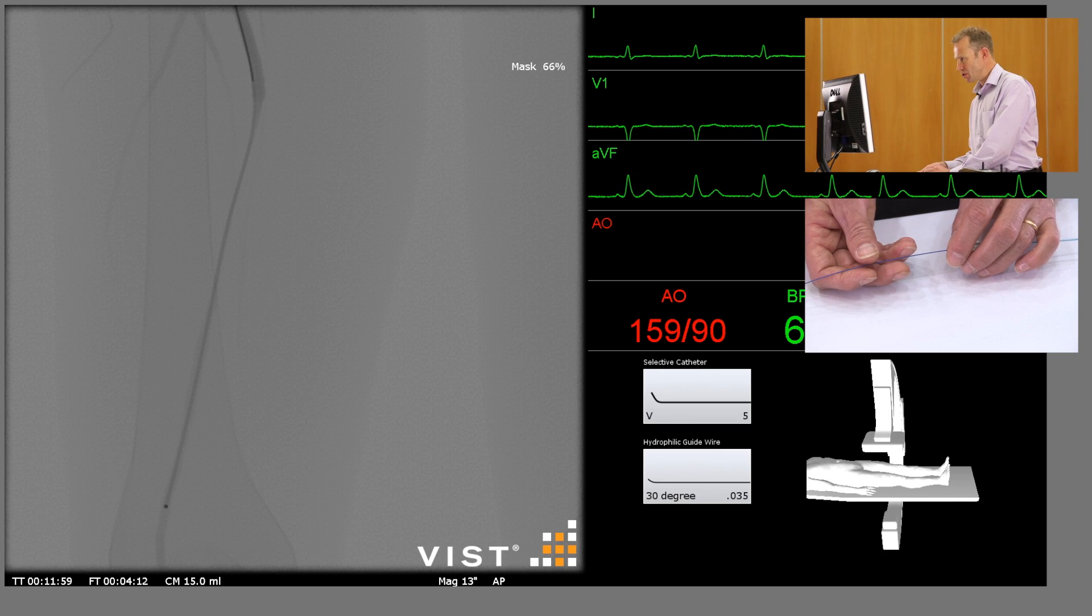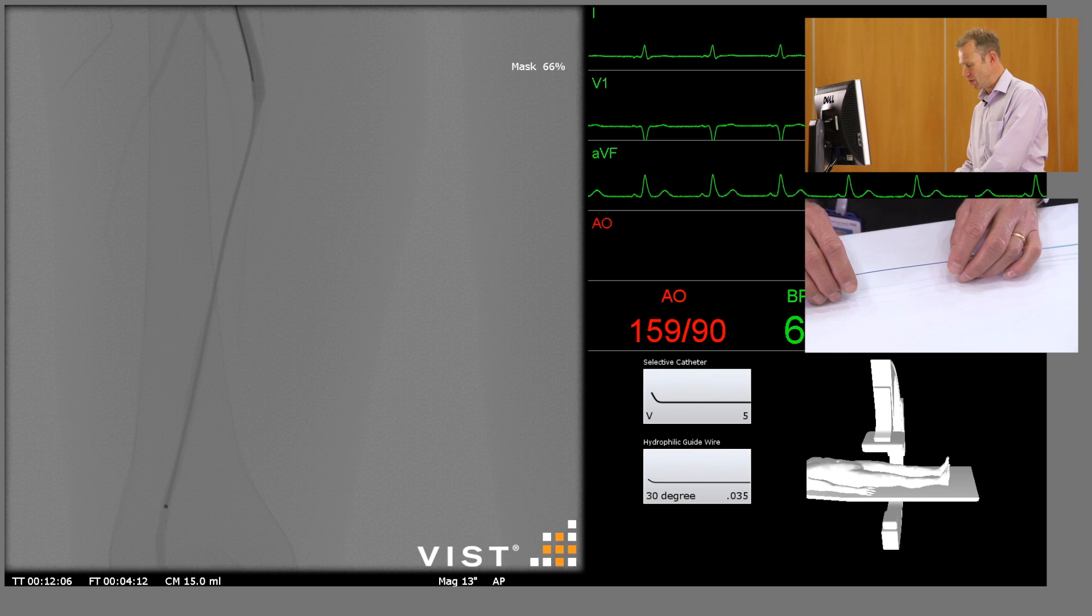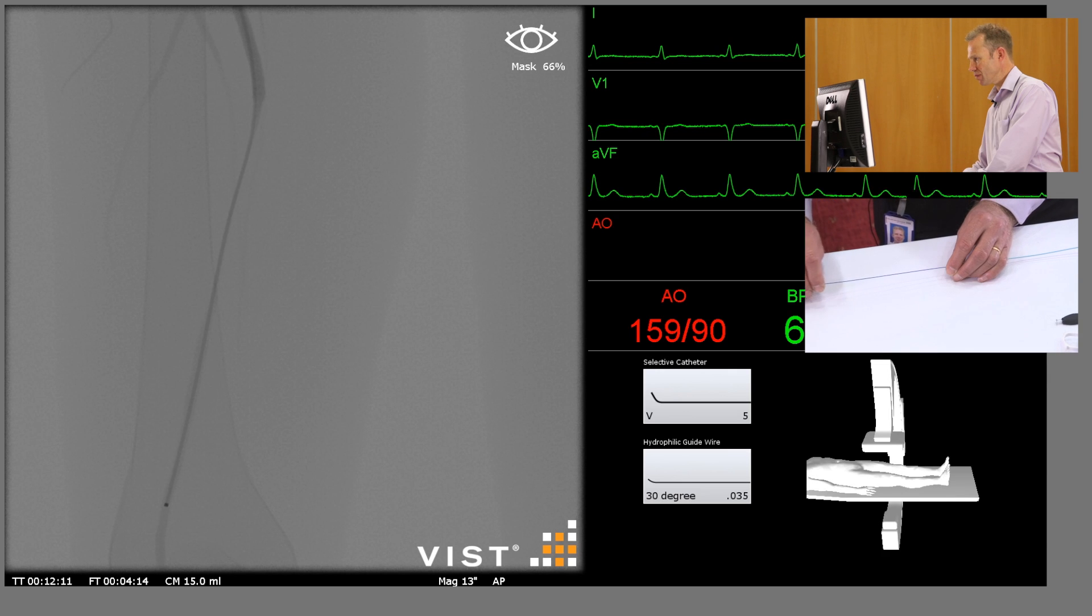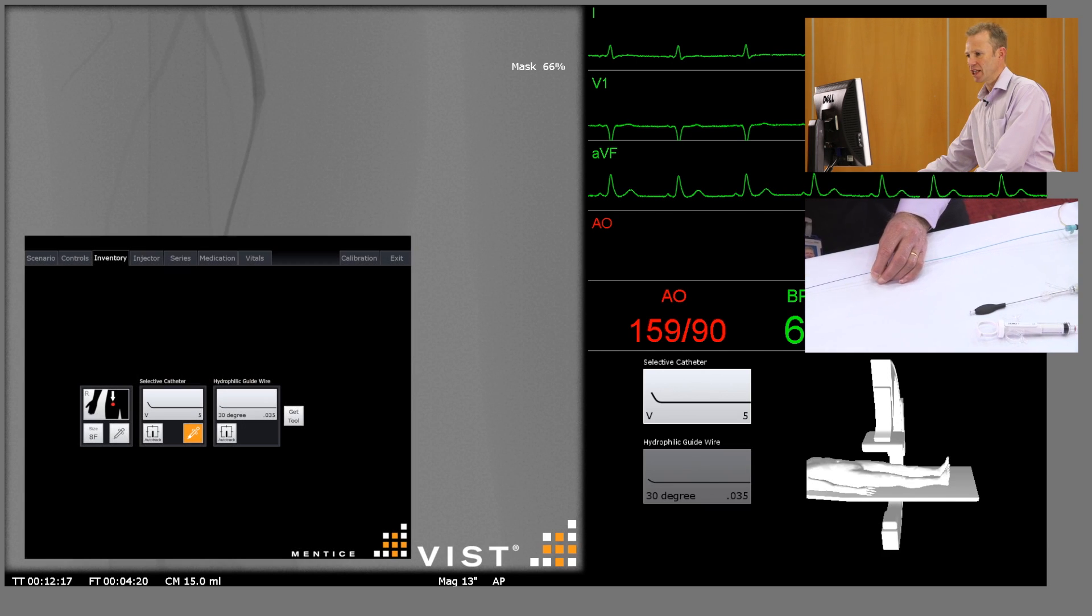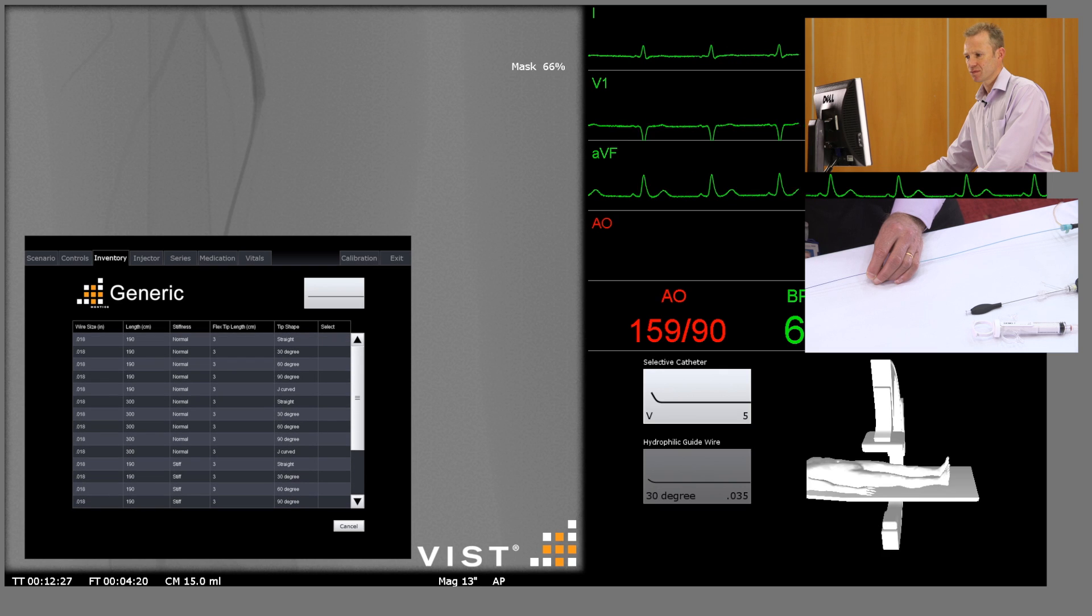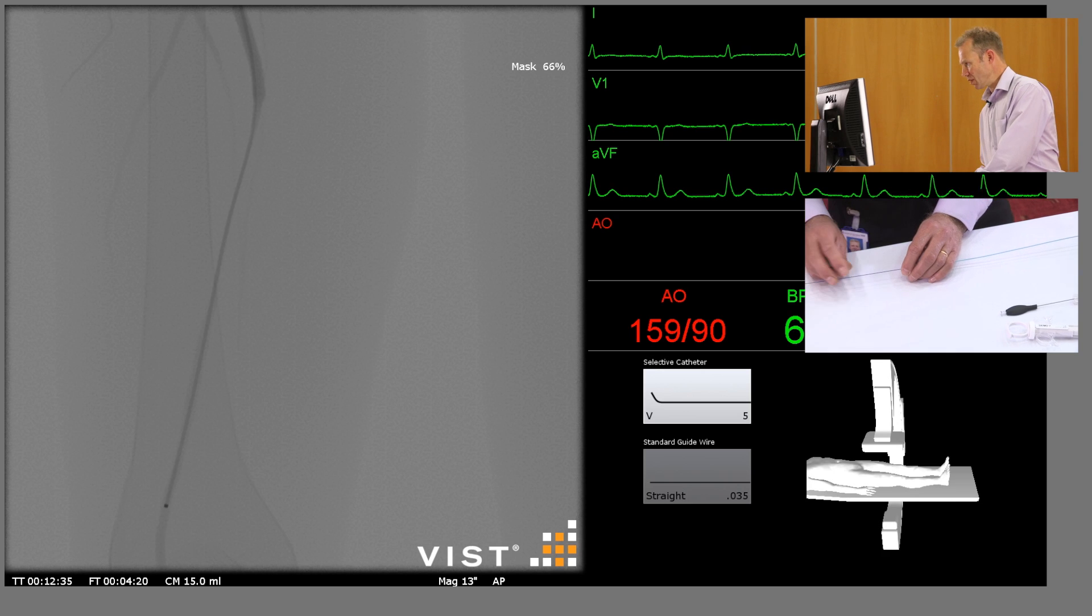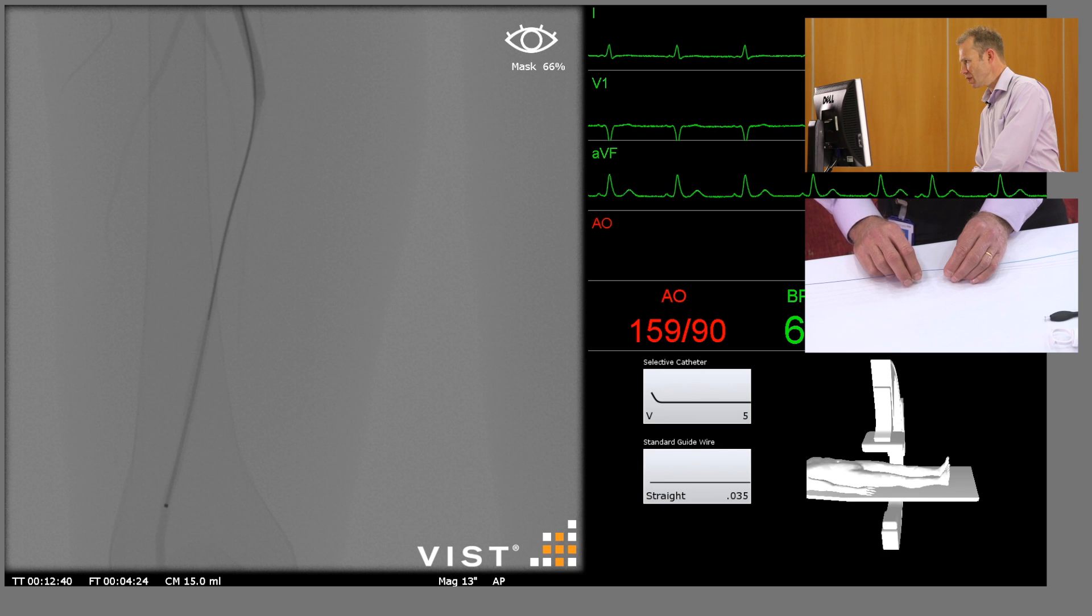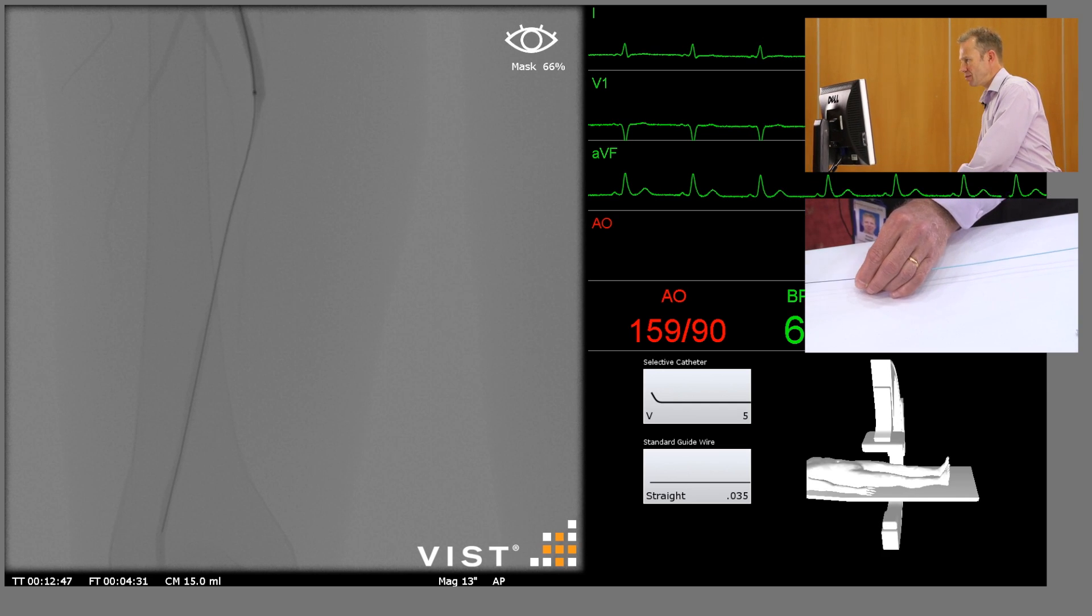So I'm now going to exchange this hydrophilic guide wire for a floppy tip Benson guide wire, which will be my working guide wire for the purposes of deploying a stent. I'm just going to pull this guide wire out, leaving the catheter in place through the lesion. We're going to select a stronger working guide wire. Now we're going to reinsert this guide wire down through the catheter and leave it in normal popliteal artery below this stenosis. Now we're withdrawing the diagnostic catheter.